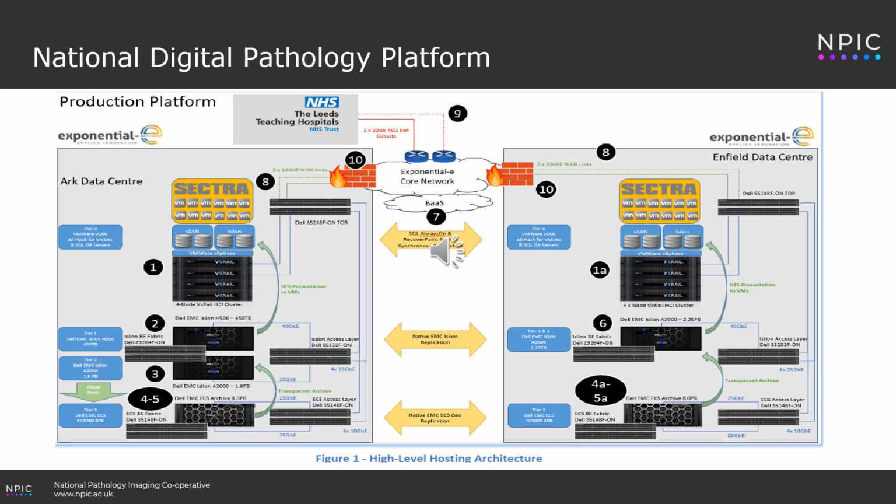Additionally, what's worth noting is any of our NHS partner sites have the ability to connect into this infrastructure. We recommend a dedicated line, but there are opportunities to also use the HSCN connection. Either way, we tend to find that having both options available provides additional resilience just in case there's a problem on one of the lines.